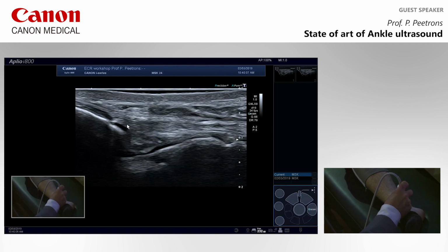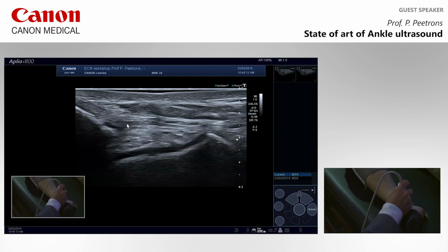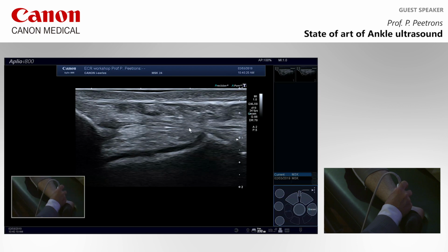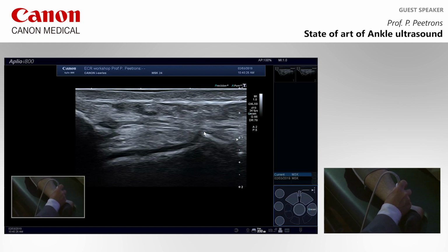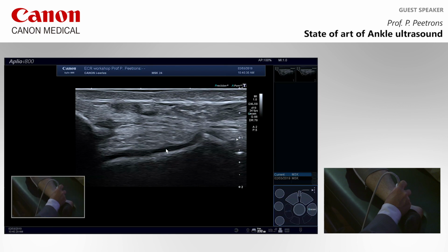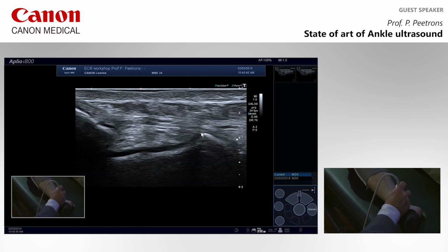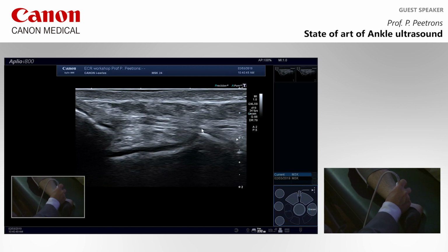And you can see when he opens the gap, you can see a little bit of the anterior tibiotalar ligament, which is coming from here and going there. It's a very, very thin ligament, very thin here, going to the anterior talus, exactly there. You know that this is the cartilage of the talus, okay? Everybody knows that. There is no ligament inserting on cartilage, okay? So you don't have to look here. You have to look just after the end of the cartilage. It's always there that a ligament is going. So this is the little anterior part of the deltoid ligament. It is inserting on the beak of the talus just after the cartilage.